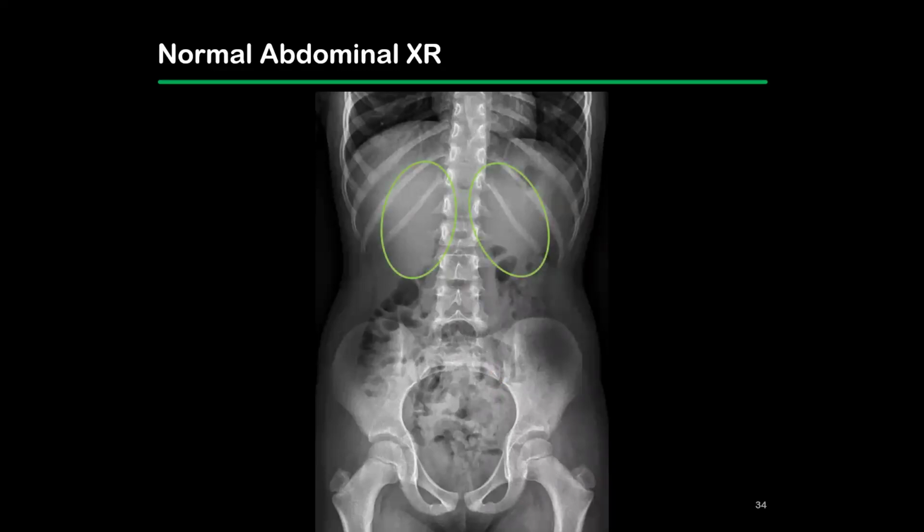We can see the kidney shadows up here bilaterally. We can also see the stomach bubble, which is an organ shadow in a way. This pink one is the liver shadow, and these blue triangles are the psoas shadows, which you can see in a pretty well done radiograph. The last organ shadow we can see is the splenic shadow. So we get an idea of the organs, even though we can't see them very well, as Dr. Masuma said, since x-ray can't really differentiate soft tissues very well.